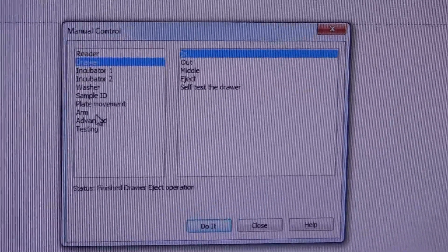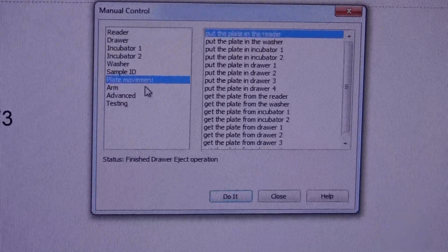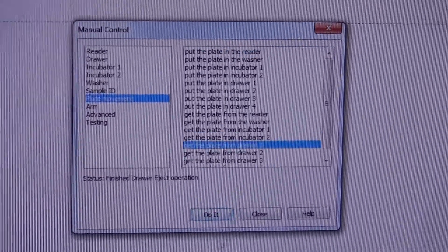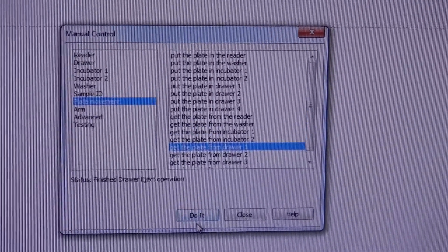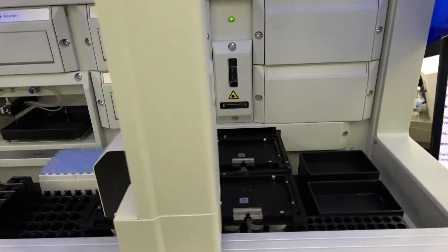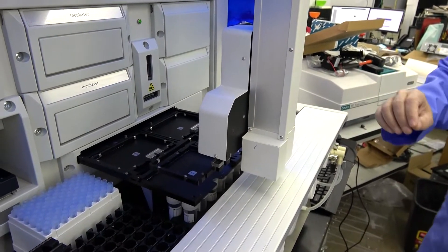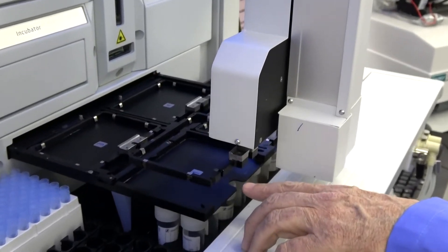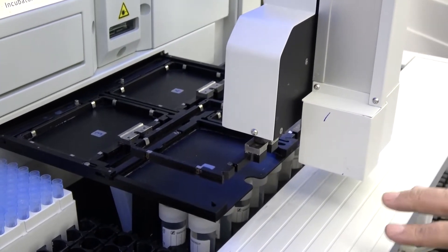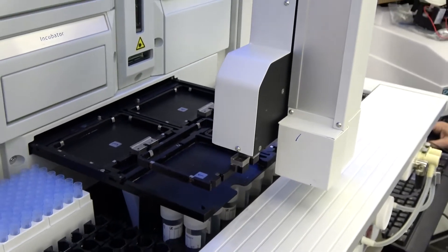Back to the drawer. Here in the plate movement function — which is something this unit will be doing a lot of — we want to get a plate or plate carrier from drawer one. You press 'do it,' it begins the process and goes and picks up one of the metal plate carriers. That would typically be carrying a 96-well microplate. From here we can put that plate carrier in any one of the positions such as the orbit reader, the wash station, incubator one, two — it doesn't matter. And we can put it back in the drawer.